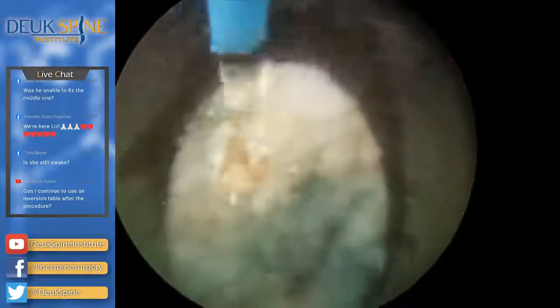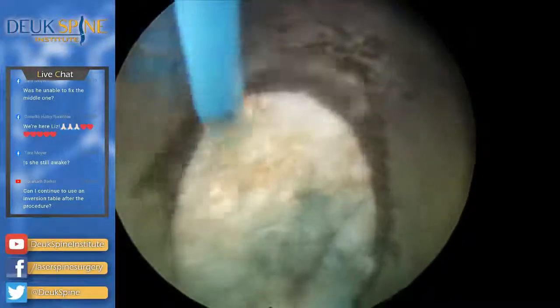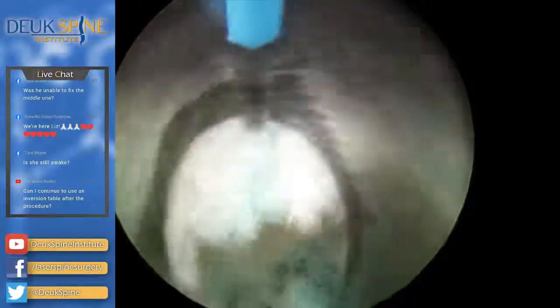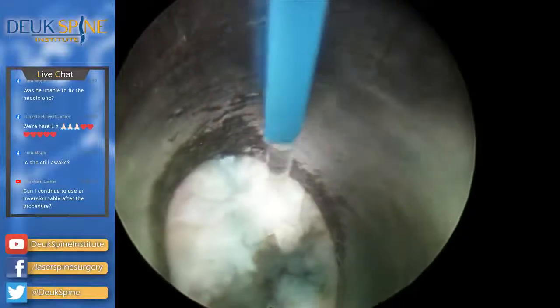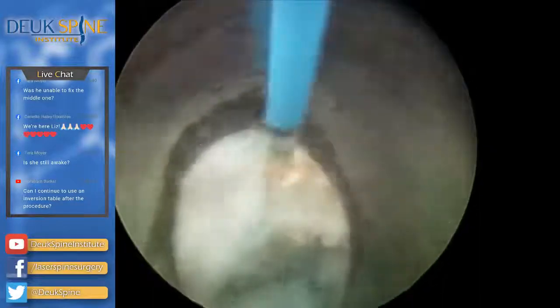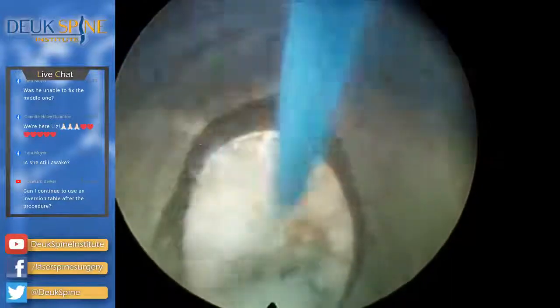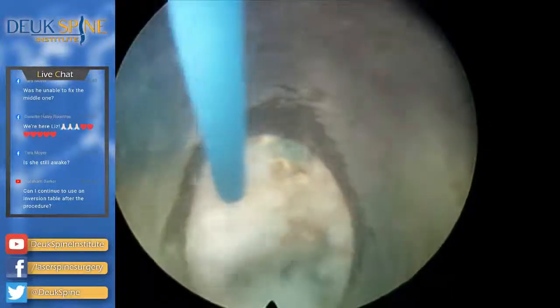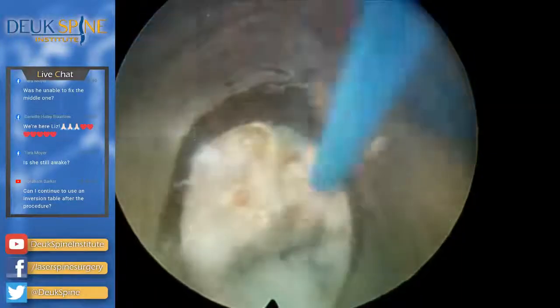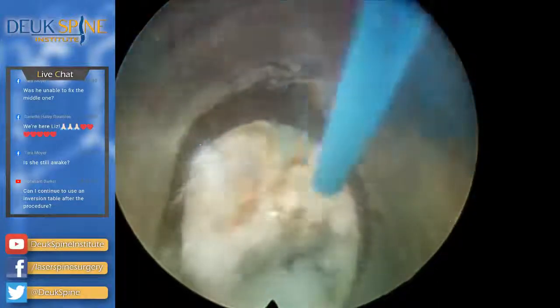This is that thick band of scar tissue I was talking about earlier, when we did the discogram and you couldn't see the tear, because this is partially healed. There's a tear right there. You see the blue? I don't know why we couldn't see it with the discogram, but there's definitely a tear there. That's where all the pain is coming from, this tear. The blue stuff is a herniation inside the tear. There's not a lot of herniation inside the tear, just a thin streak of blue. So this would be a skinny, very thin herniation.